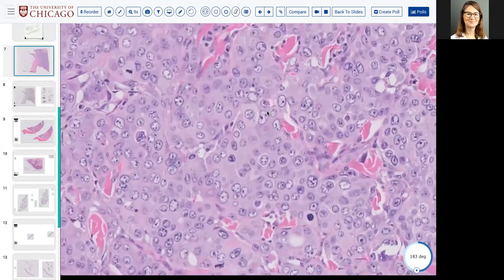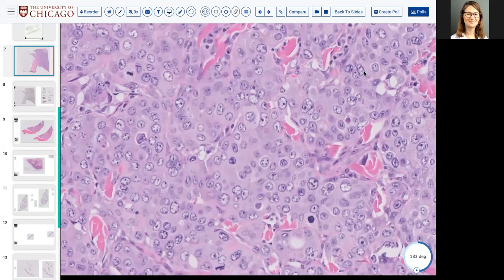What else do you want to know if it's INI1 lost? What are our options now for INI1 lost tumors? They can be carcinomas, sarcomas. What other information do you want? Are you going to do a keratin? Maybe like an EMA. Yeah. Okay, what do you expect for this one? Positive. Yeah, yep.